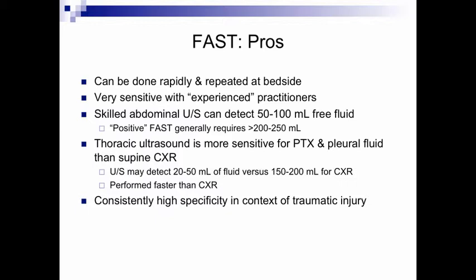Versus chest X-ray, thoracic ultrasound performed in the context of extended FAST exam has been demonstrated to be more sensitive for a pneumothorax, more rapidly performed, lessening time to chest tube placement, and so on in published literature.